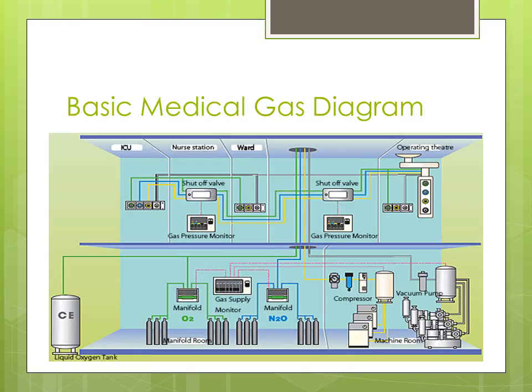So here's the room again. Okay, we got one tank. Okay, it's just a picture, but there should be a second tank. The thing about the monitor is this. Here's the gas monitor, okay? And interestingly enough, it's in a room that appears to be with all the manifolds and all these other tanks. Is this a rated room? Well, it almost certainly would have to be a rated room because, here's our wall. And when you have these tanks like this, all this has got to be a rated room.